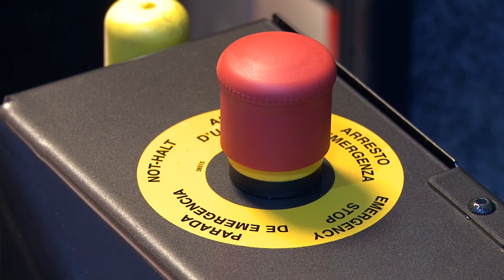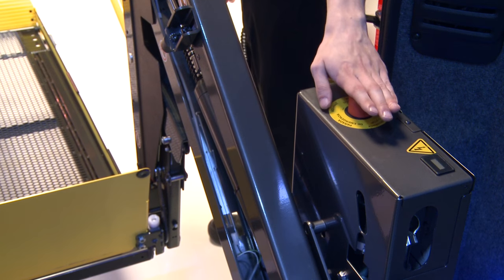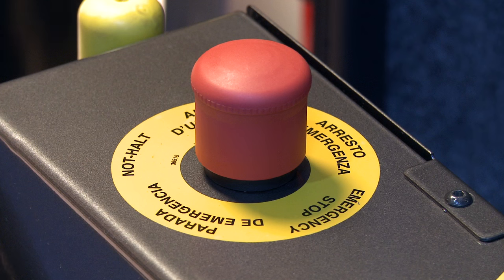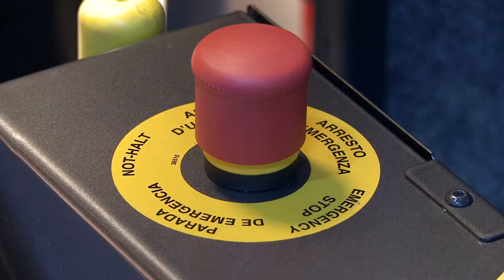Emergency stop can be used at any time to stop the lift operation by pressing down the emergency button. To reset the emergency stop mode, pull the button upwards.